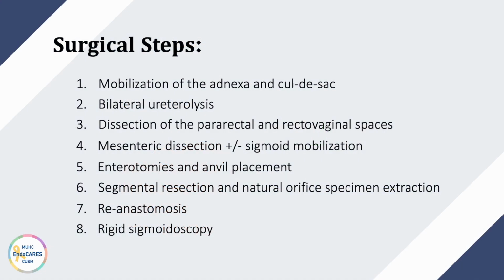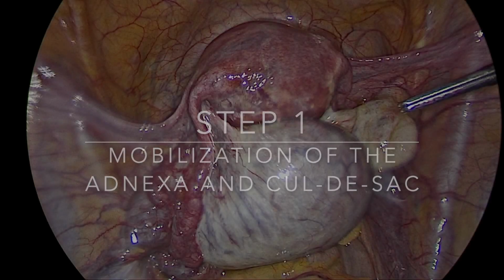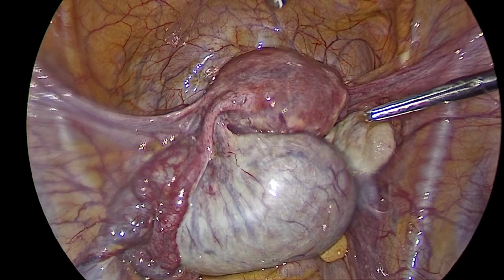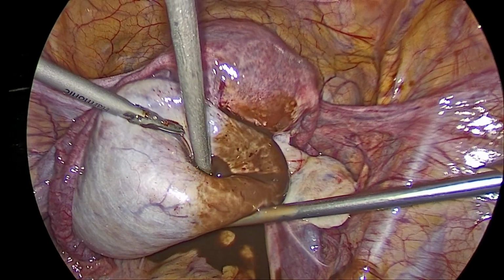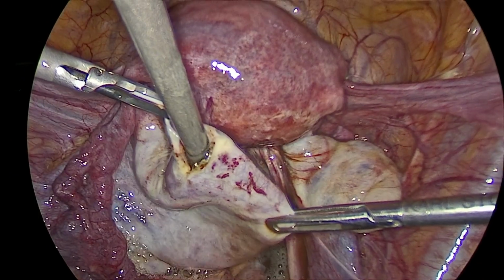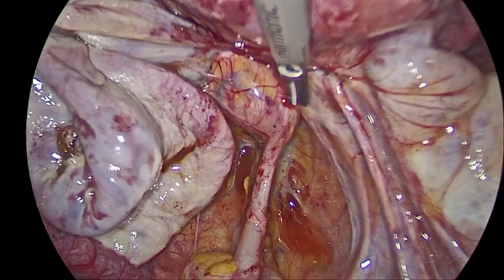The surgical steps should be kept systematic and start with the mobilization of the posterior compartment, followed by the mesenteric dissection, resection of the diseased bowel segment, and the primary reanastomosis. Examination of the pelvis shows a normal-sized uterus along with a left endometrioma adherent to the left uterosacral ligament. Large endometriomas often obliterate the pouch of Douglas and must be drained and released to allow visualization of the posterior cul-de-sac.